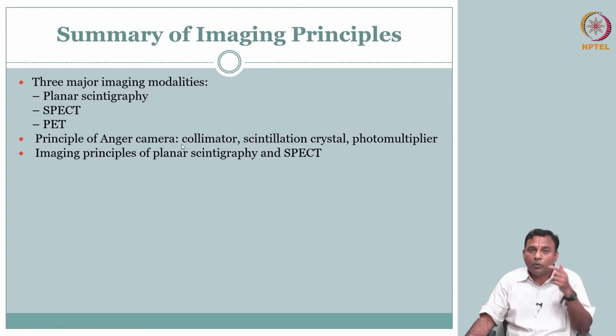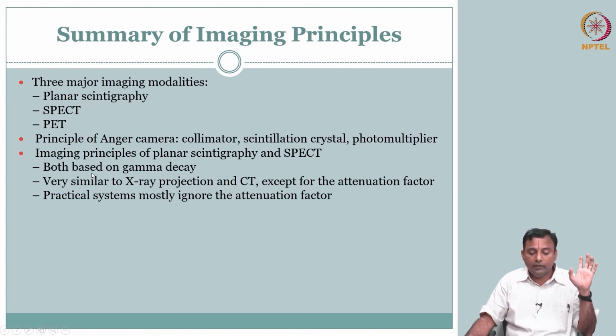Recall, right, we talked about how we use your x, y, z pulse, that is an important concept when we talk about Anger camera. Okay. Apart from that, we talked about the imaging principle here, and essentially we argued it is gamma decay that we are interested in. So, for most part SPECT is very similar to the X-ray projection that we did and X-ray reconstruction, X-ray CT that we did.